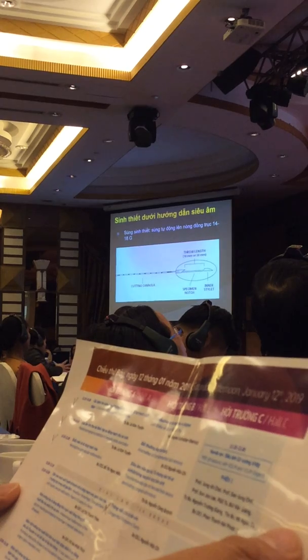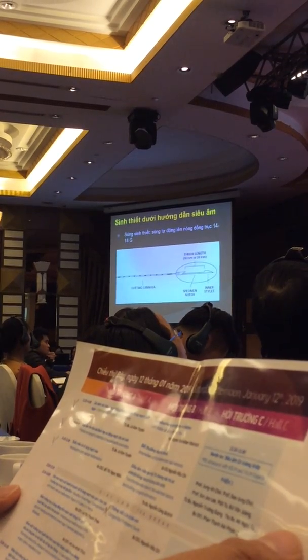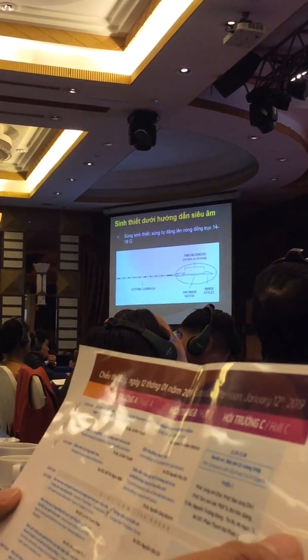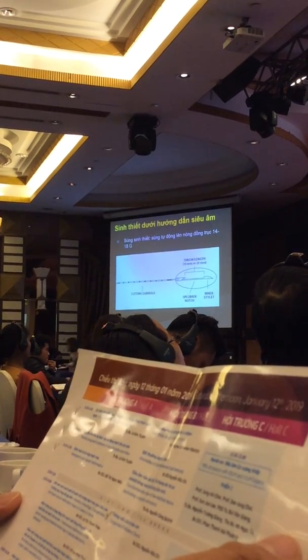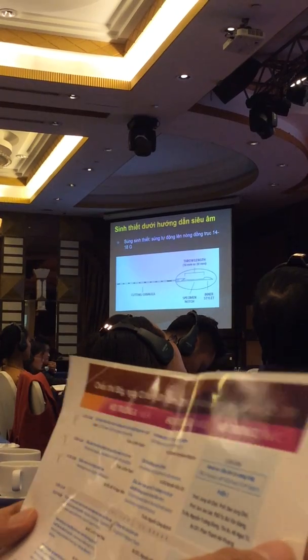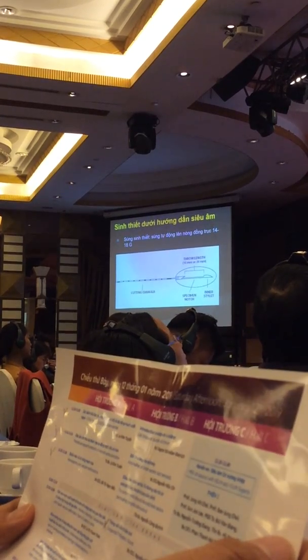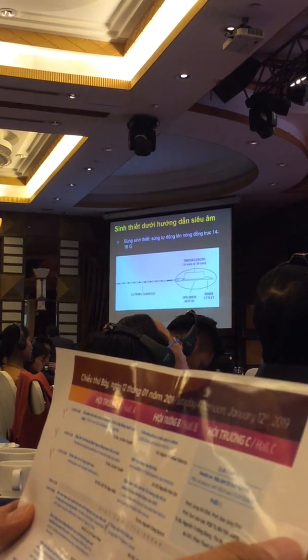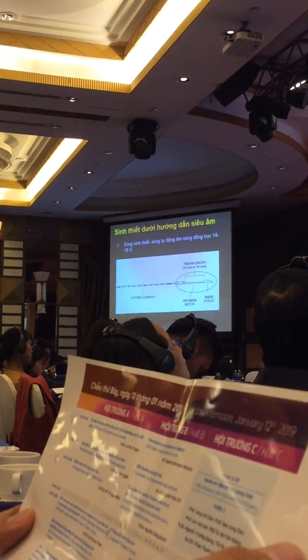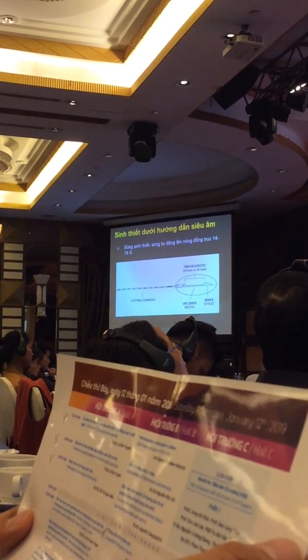As you can see in this picture, there is a core. When you shoot out the core, you see this notch, the throw length of 1 or 2 centimeters for the specimen. And then when you shoot the gun again, the sheath comes out and cuts into the tissue.